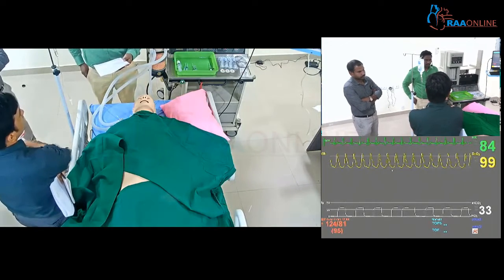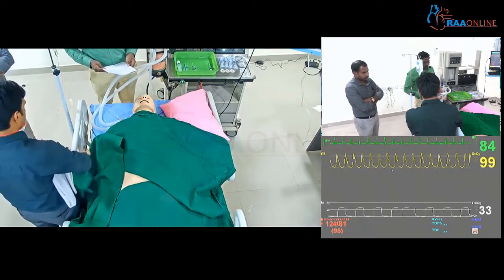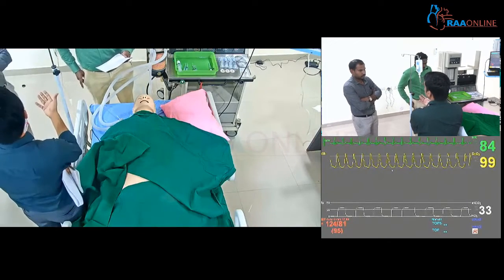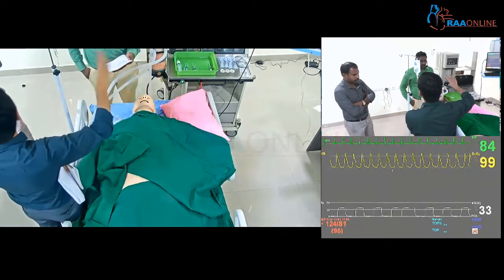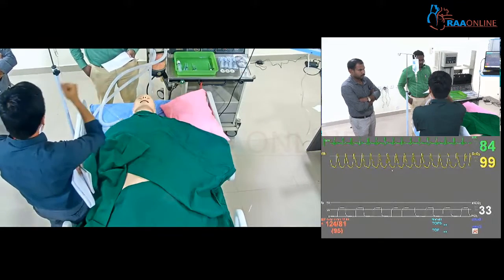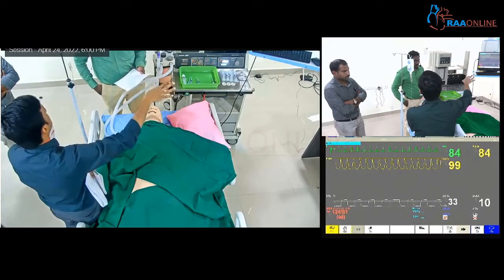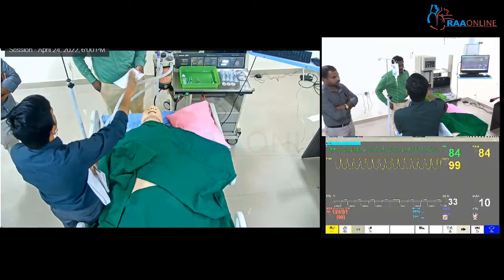So we have propofol and drugs available. The technician will just show them, but won't give them as such, but we'll assume that the drugs are given. Some things will be presumed, some won't. Like mask ventilation, even if the bag is not filling, the capnography flow has to come. Ventilation has to have all these things. Laryngoscopy won't be presumed. You can actually do a laryngoscopy and then do the intubation. You should get the capno and all the hemodynamic changes, tachycardia, managing the depth of anesthesia, all these things will be there. No vaporizers are available, but we'll assume that they are available.